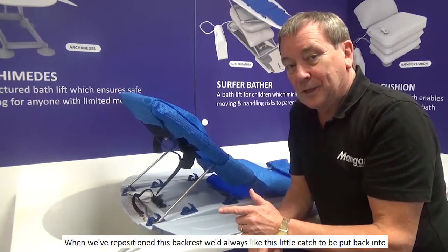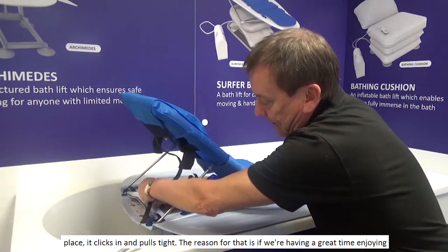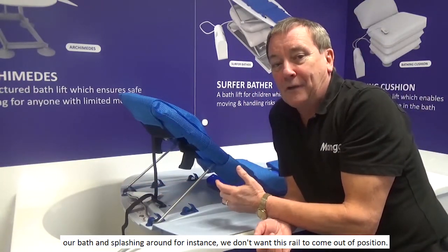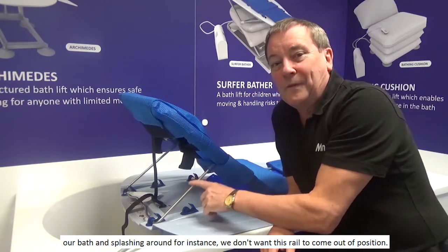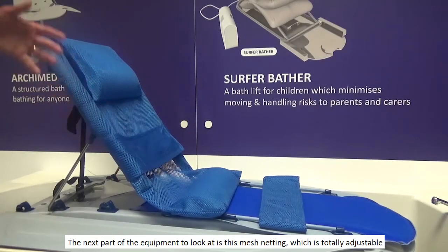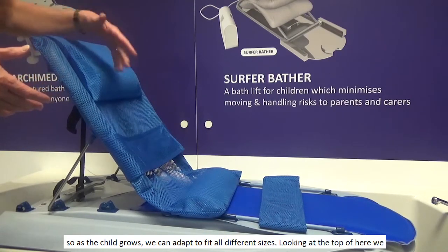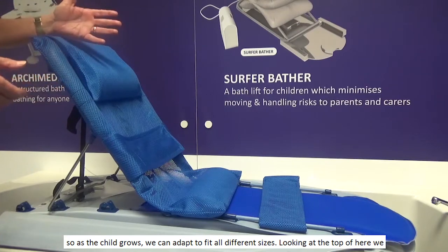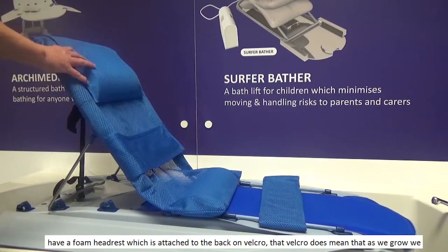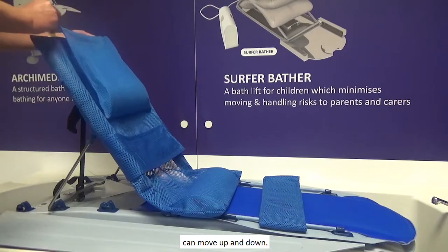When we've repositioned this back rest, we'd always like this little catch to be put back into place — it clicks in and pulls tight. The reason for that is if we're having a great time enjoying the bath and splashing around, we don't want this rail to come out of position. The next part of the equipment to look at is this mesh netting, which is totally adjustable, so as the child grows, we can adapt to fit all different sizes. At the top we have a foam headrest, which is attached to its back on Velcro. That Velcro means that as the child grows, we can move it up and down.